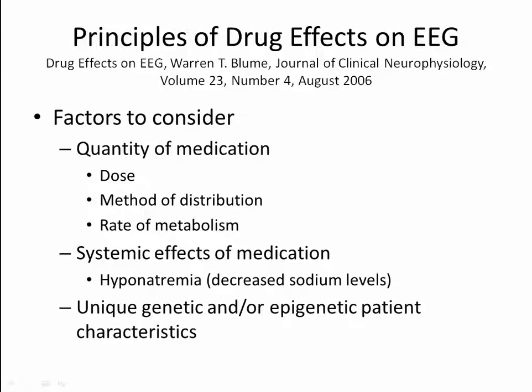So, one of the issues about this topic is that medication effects, generally speaking, are quite different from person to person.